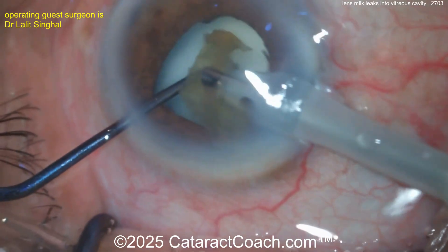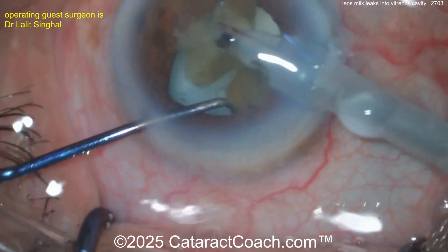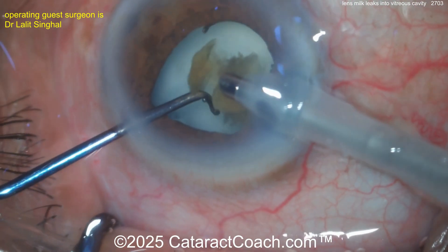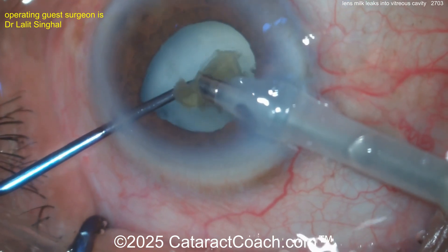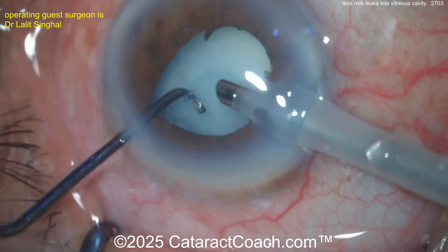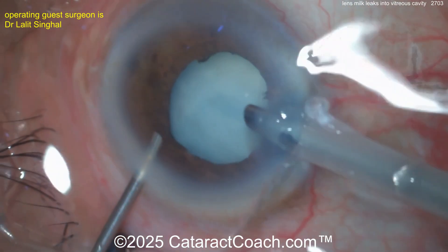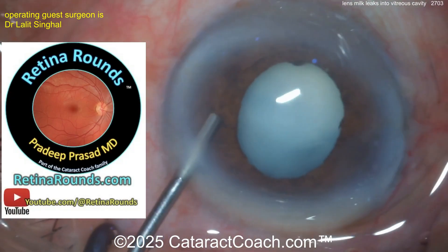The lens will come out nicely, but the question is: do I do a posterior rhexis and try to aspirate or wash out some of the fluid? Do we keep the posterior capsule intact and instead do a pars plana trocar placement with a little anterior vitrectomy? There's all the lens material coming out, and now you've got an empty capsular bag. There's the viscodissection going inside — yeah, that's a smart move. Really no lens cortex remaining.